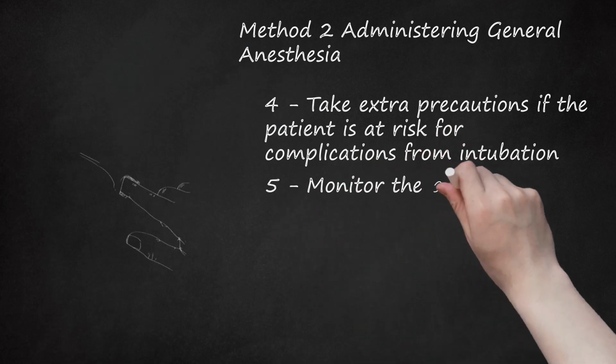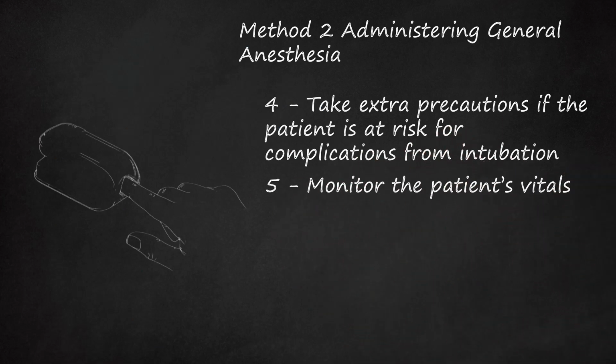5. Monitor the patient's vitals. Once the patient is under anesthesia from IV or inhaled induction, with a secure airway and appropriate ventilation, the anesthesiologist will monitor the patient's vital signs and treat the patient with a variety of medications and fluids to keep her stable throughout surgery. The anesthesiologist will communicate with the surgeon throughout the procedure to ensure the patient's safety.